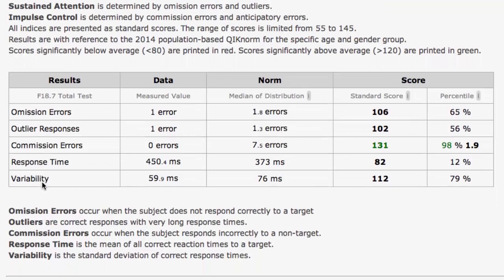Variability is the spread of the distribution. So if somebody has a lot of very fast presses and a lot of very slow presses, they're going to have a very large number here. So we have the actual measured value: this person here had one omission error, one outlier, zero commission errors, a response time of 450 milliseconds, and a variability of 59.9 milliseconds.